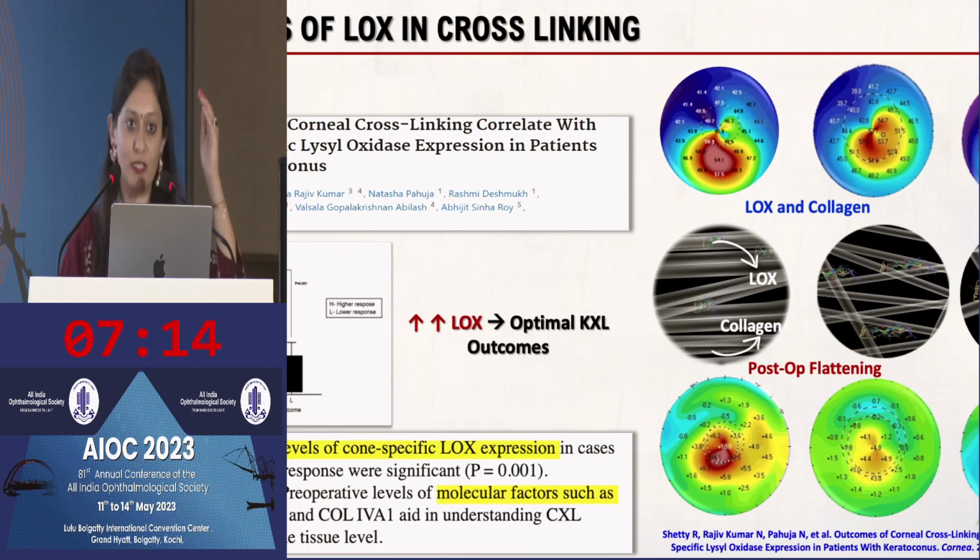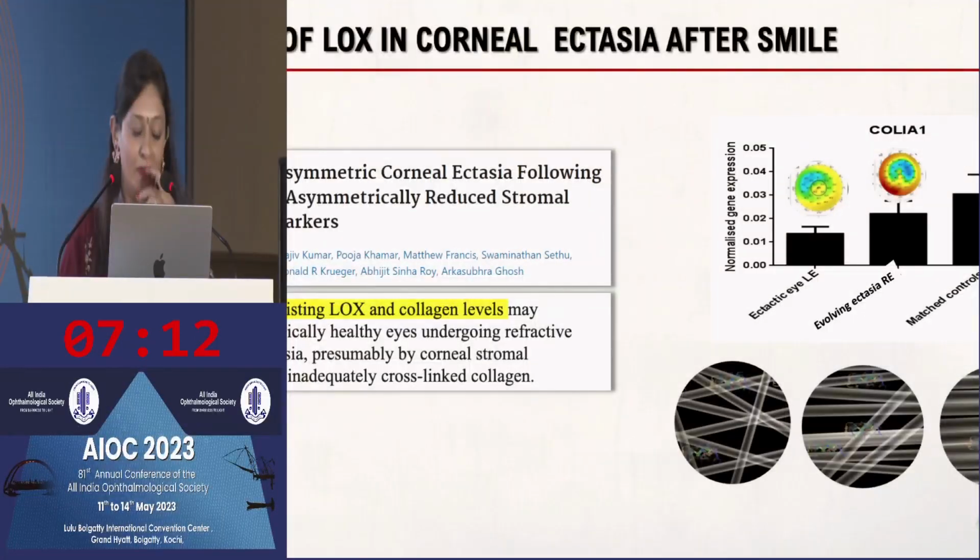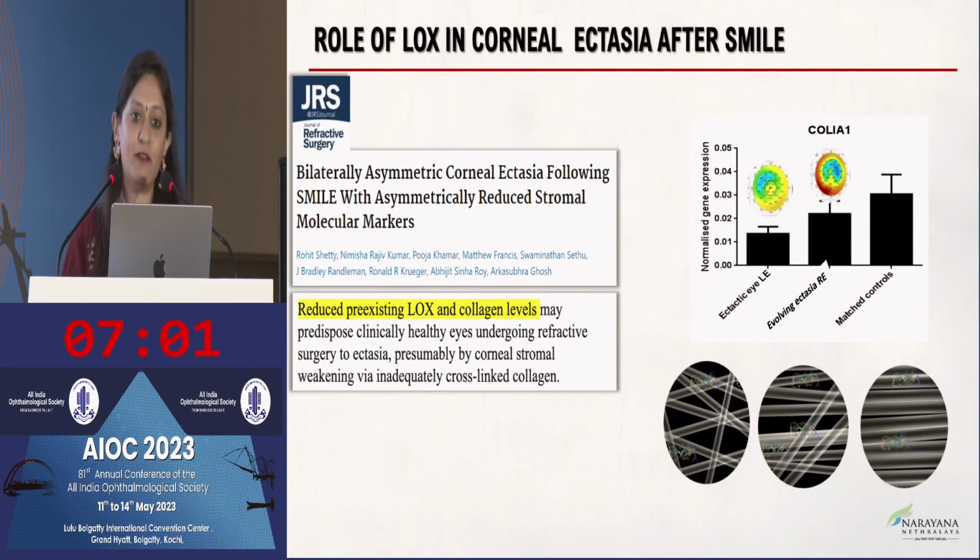And we were the first to report that post-SMILE surgery, a patient with normal topography and biomechanics underwent SMILE. But after SMILE surgery, the patient developed ectasia. If patients develop ectasia in LASIK, we cannot evaluate why it happened. But in SMILE, we had the lenticule, and it did show that the patients had lower levels of lysyl oxidase and collagens to begin with.